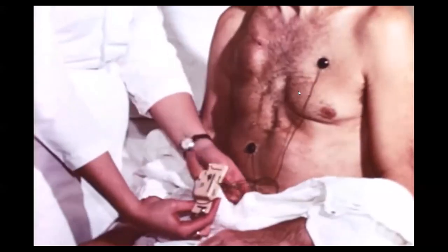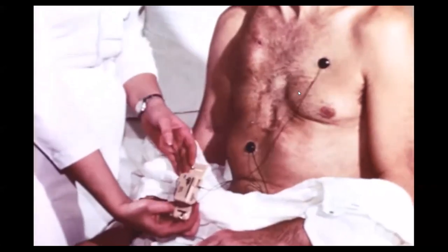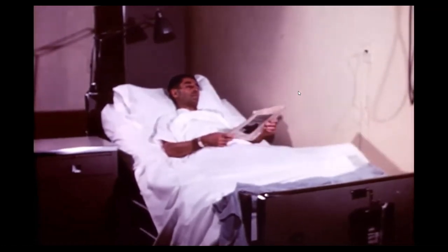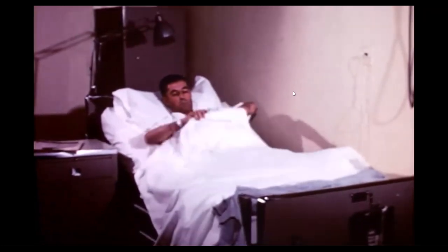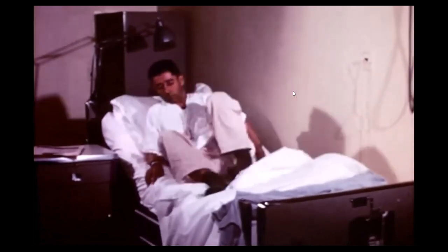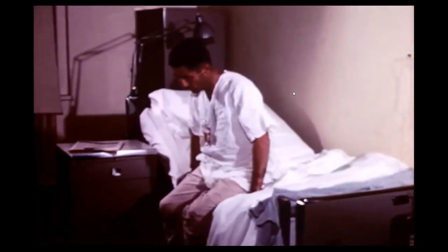This man is a chronic heart patient. He wears two electrodes attached to the transmitter, and you can see the simplicity of the system. He enjoys considerable mobility even while being constantly monitored. Before this NASA unit was available, a patient had to remain encumbered by long electrocardiographic leads in order to be monitored. Now a heart patient can be followed throughout the day, and if danger signals do appear, a physician can be dispatched immediately to treat the patient.